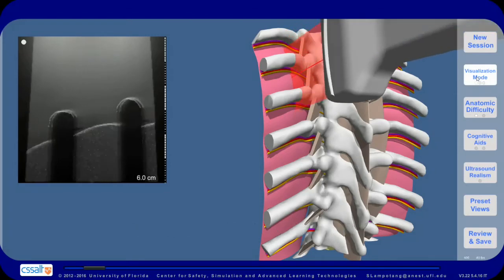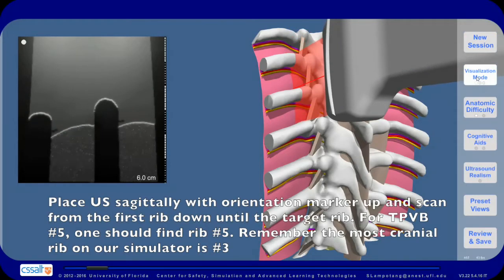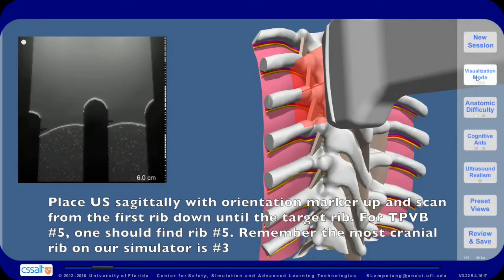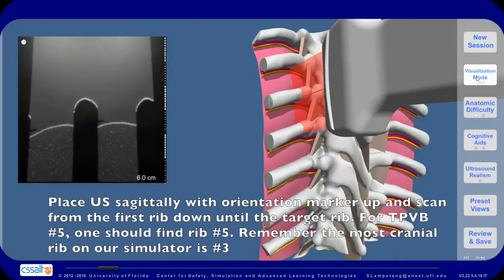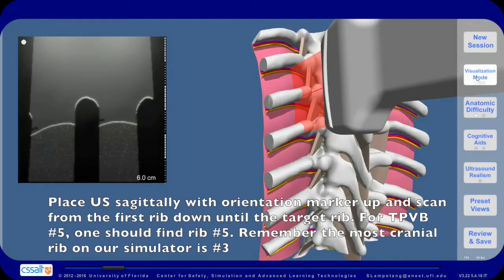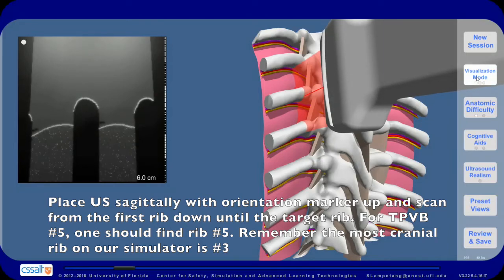Note that counting ribs with an ultrasound is preferred when it is difficult to palpate spinous processes. Place the ultrasound sagittally with the orientation marker up and scan from the first rib down until the target rib. For TPVB number 5, one should find rib number 5.